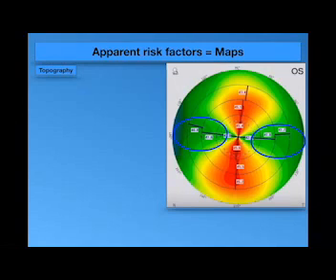The second point is the Q value. The Q value, you will find in the right side and in the bar of the printout from the Pentacam, either in the right or the left with the data of the patient, you will check the Q value. I will show a paper about it after in the coming slides.